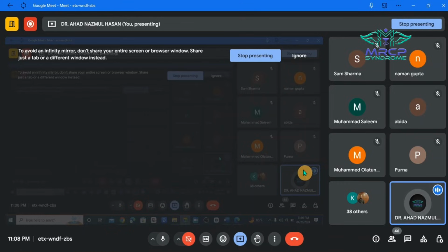And CT scan is only limited to the axial view. You cannot go for other views like the coronal view or some other view. The CT scan can only be obtained in the axial view. And the CT scan cannot detect the acute ischemic stroke when the duration is less than 2 days. The CT scan does not detect demyelination. For any demyelinating condition, you should always go for the MRI. And the CT scan also does not detect the lacunar stroke, especially when it occurs within the brainstem.